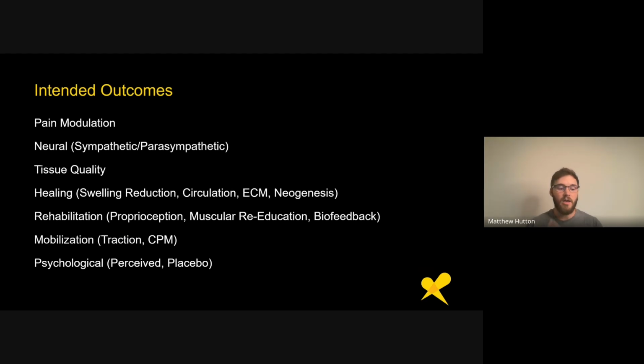I even saw, this is probably a bit outdated now, in 2013, 2014, a Nintendo Wii where one of the games was like a balance board, and they were using it to detect asymmetries in either squat or what I think they call quiet stance. You're just seeing, with eyes closed, how the body is balancing.